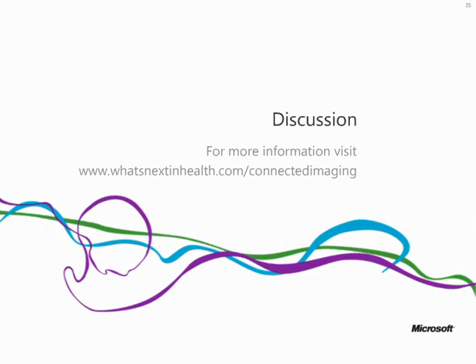So without Amalga, you would really need, first of all, to get data into some place. So even though a lot of enterprises are investing in data warehouses, most of them today do not cater for DICOM data. They don't even have DICOM data, so it's very difficult to do study level or image level analytics on that.